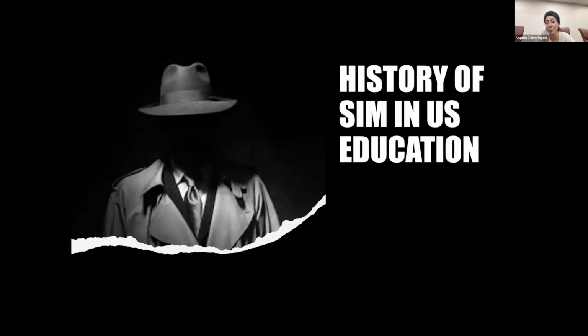For the history of SIM and ultrasound in particular, there again isn't great data pointing to one ultrasound SIM model in particular. There was a Lancet paper as far back as the 1950s on ultrasound, again using OBGYN, where they looked for pelvic masses, and they were able to identify babies in that paper as well, like a fetus on ultrasound. So it's more of a mystery where ultrasound started in SIM and what the models were like, but that was the earliest that I could find, in the 1950s.